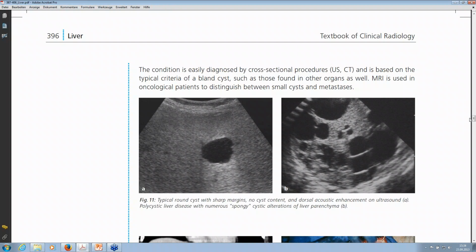Okay. And the last question is: if you compare the echogenicity of the liver to the kidney, is it always possible, or are there kidney diseases which don't allow this comparison? It's exactly like this. When there is a kidney with high echogenicity because of chronic renal failure, then you possibly take the spleen to compare.